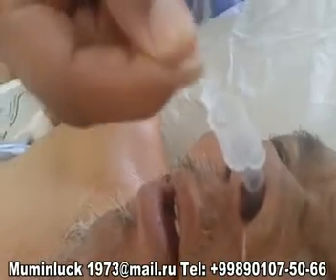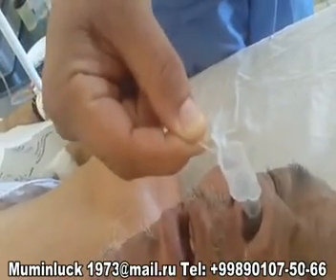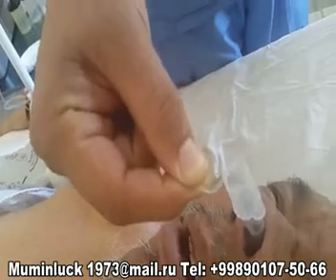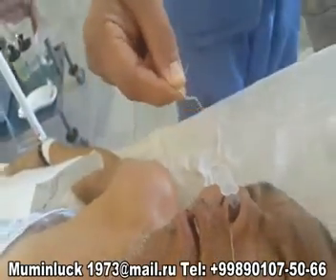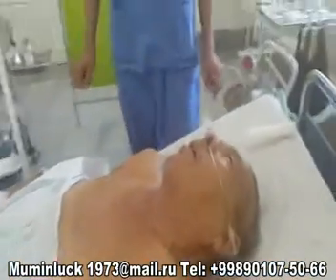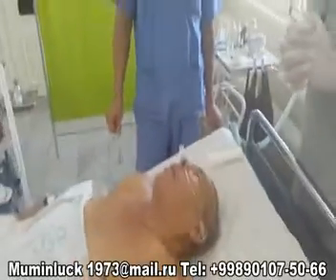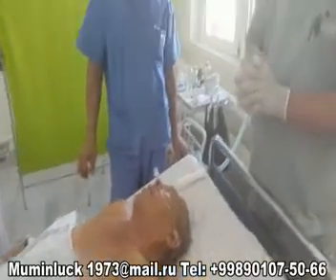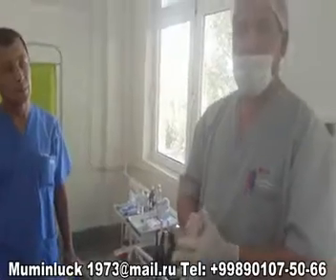After intubation, we inflate the cuff and begin our anesthesia. Sometimes for sensitive patients, at the time of inserting the tube, we use 30 or 40 mg of propofol for sedation. Having used propofol in a minimal dose, we are able to maintain the spontaneous breathing of the patient.